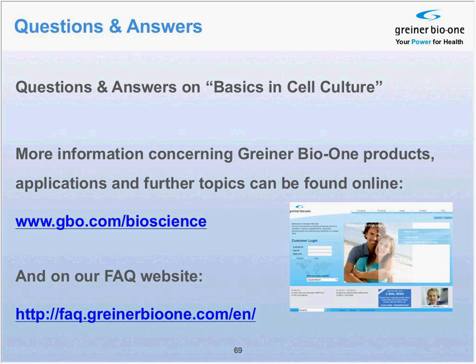Okay. And if you're treating a culture for contamination and an antibiotic doesn't seem to be working quickly, would you recommend trying another antibiotic? Definitely. I would definitely try another one.